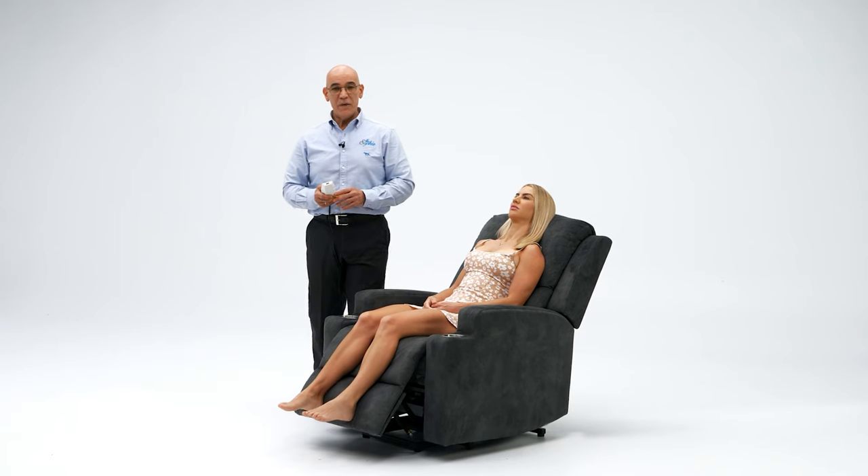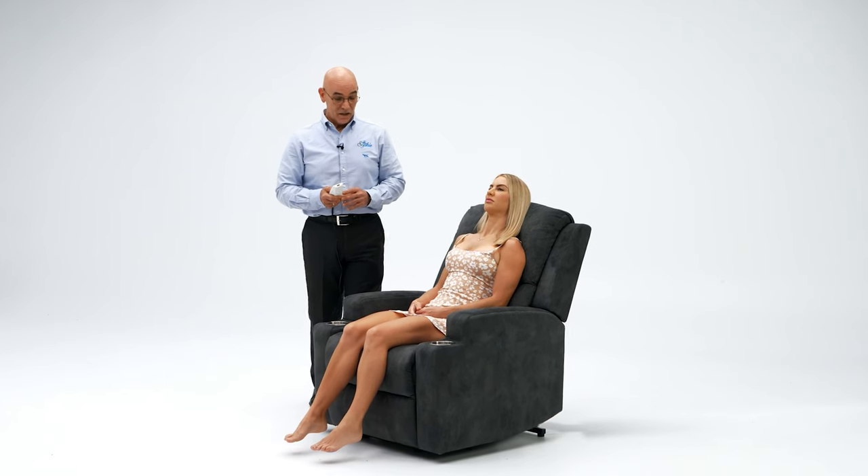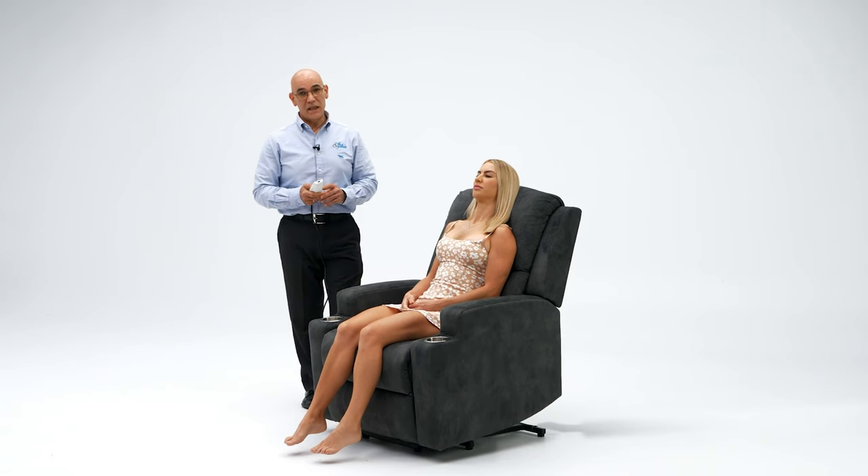The heavy-duty steel frame and motor that the chair has is a sealed motor, so there's nothing to maintain on the motor. It gives a total weight capacity of 180 kilos.